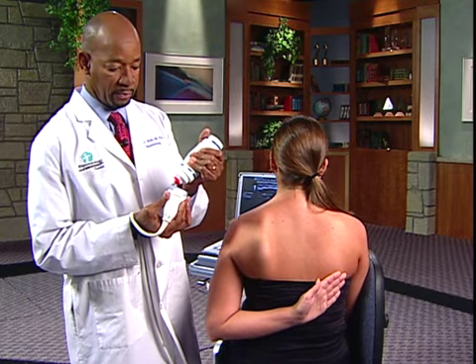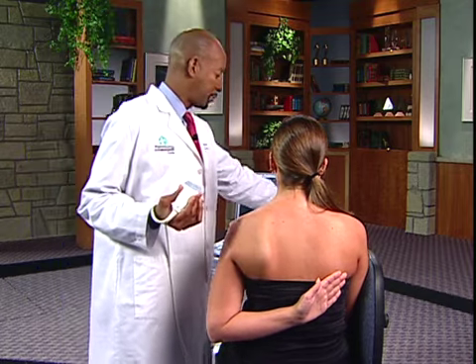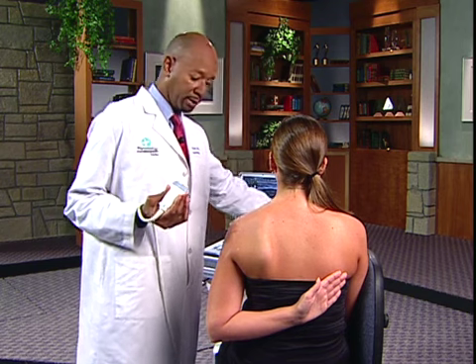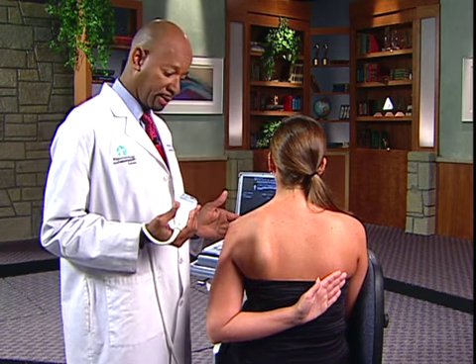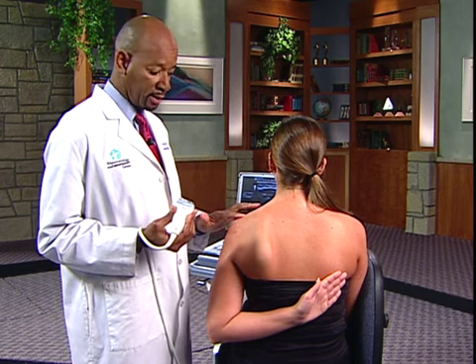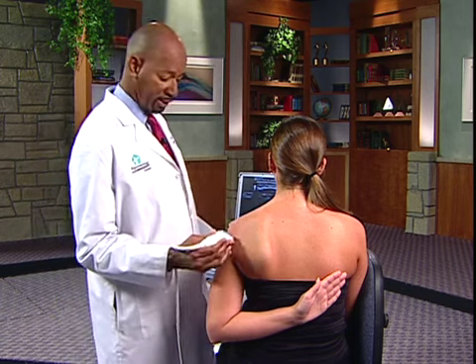Keeping the patient in the same orientation, we will look at the third tendon involving the rotator cuff. So we've taken a look at the anterior subscapularis, we've looked at the supraspinatus. I will now look at the infraspinatus.